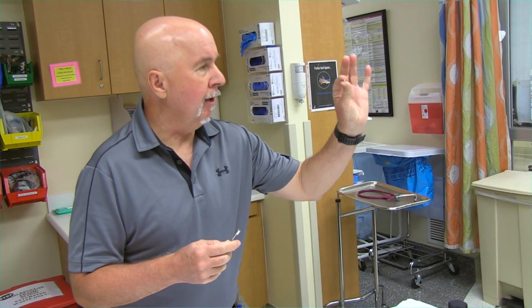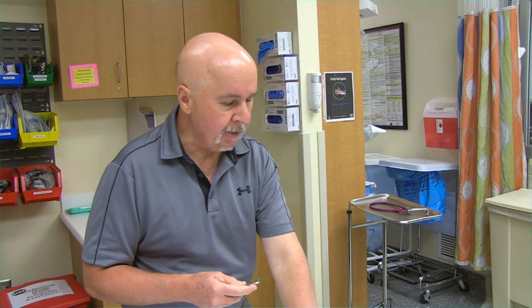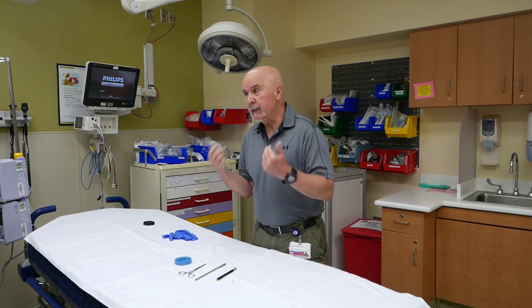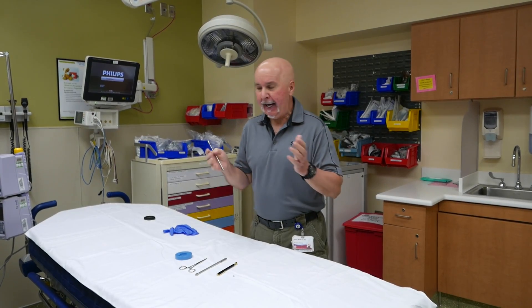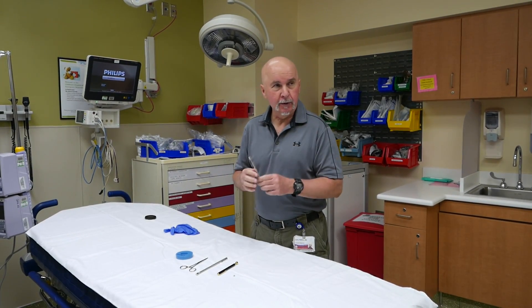What I'm going to do is demonstrate the removal of a hearing aid battery — very small, the smallest hearing aid battery you can find. I want to use myself as a model here, and we're going to drop the hearing aid battery in my ear and then use one of these tools to remove it.